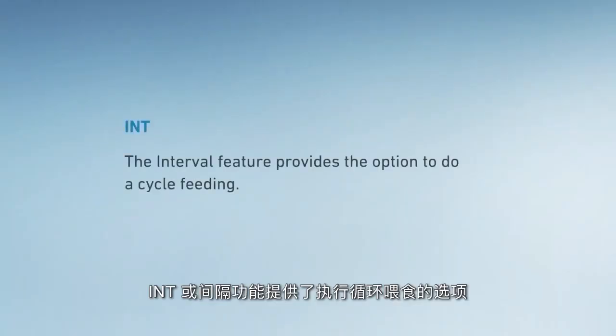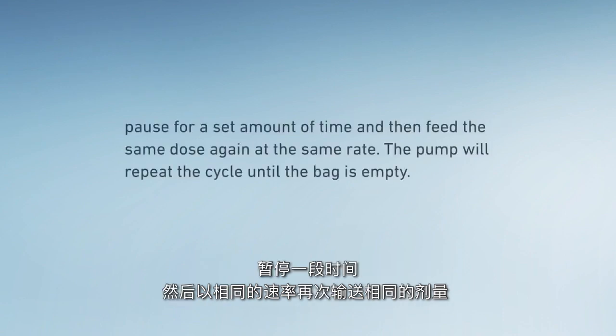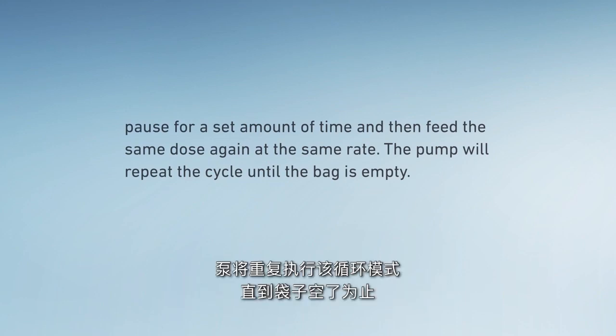The INT or interval feature provides the option to do cycle feeding. Users can set the pump to deliver a prescribed dose at a specific rate for a particular time, pause for a set amount of time, and then feed the same dose again at the same rate. The pump will repeat the cycle until the bag is empty.